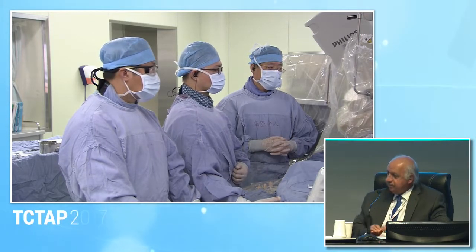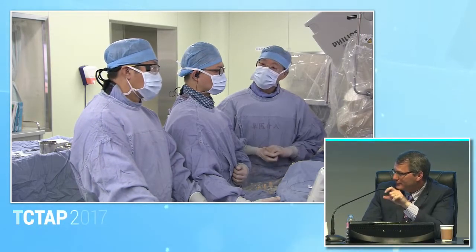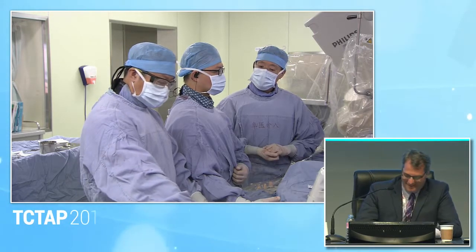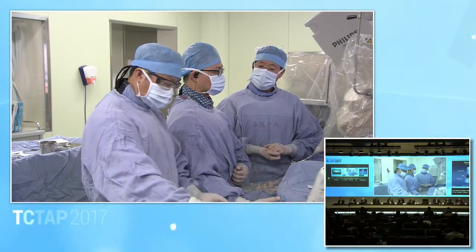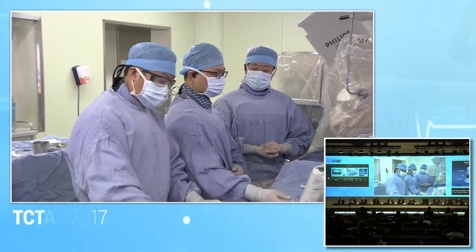Well, I think we should give him a better revascularization than the surgeons can give him. So I would definitely do the distal circ. And I wouldn't do FFR now that I see it's 95%. I agree with that. Yes. There's nothing intermediate about it. Do the circ. Okay, do the circ.